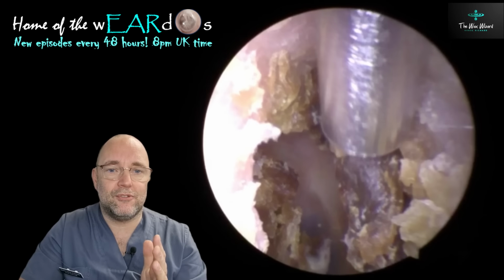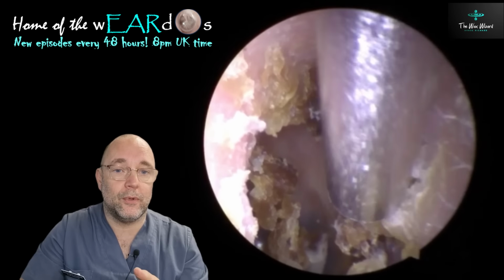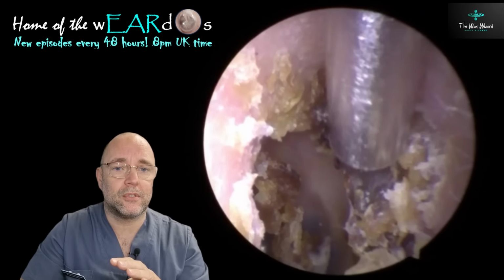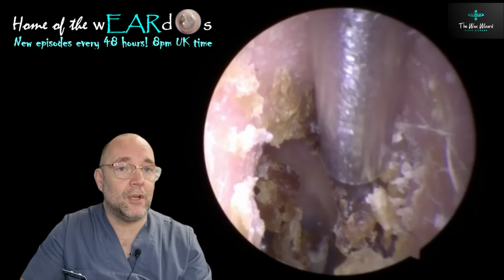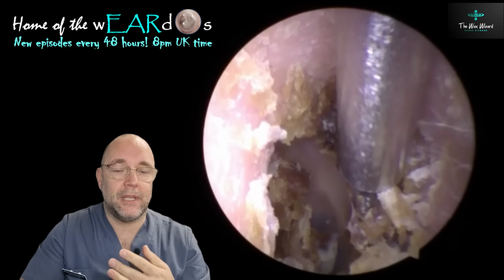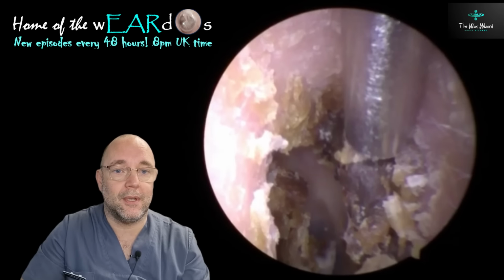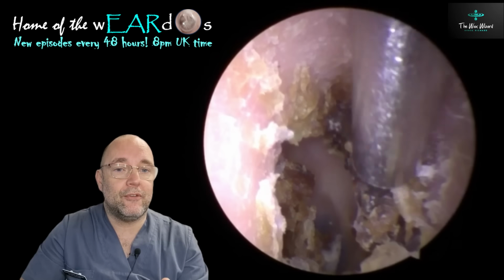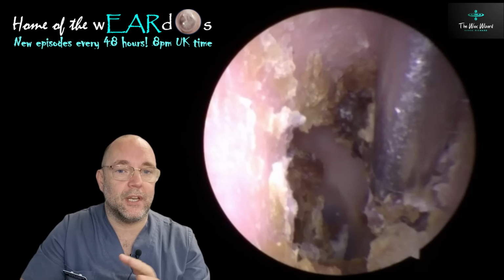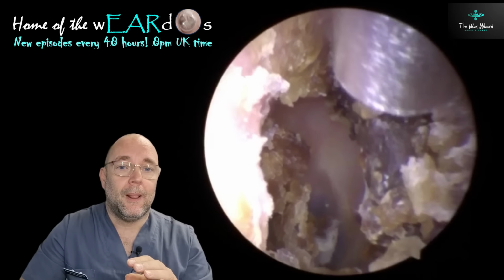An extremely dry one. It was really crusty. Now this chap always comes to see me every 3 months. This builds up. I think he's been in one of these videos before, but it's a bit of a last minute one. He normally oils it beforehand. I believe he's going in hospital for a new hip, and he wants to be able to hear everything that's going on in the hospital, as you would when people are chatting to you about your health. And he's a hearing aid user, and so it was a bit last minute. We got called in, so he said, I need to get my ear sorted out before, because I might be in hospital for some time. So that's why he didn't oil it.